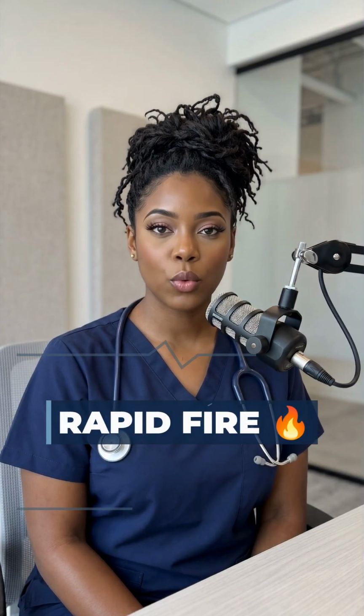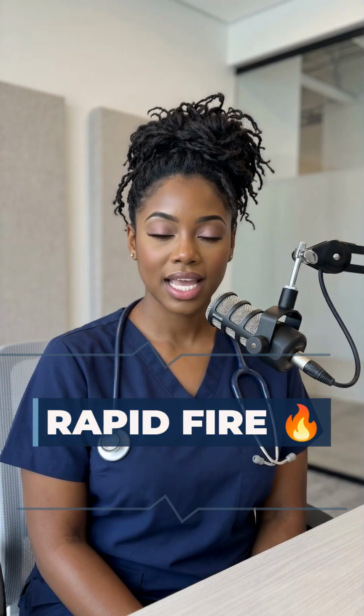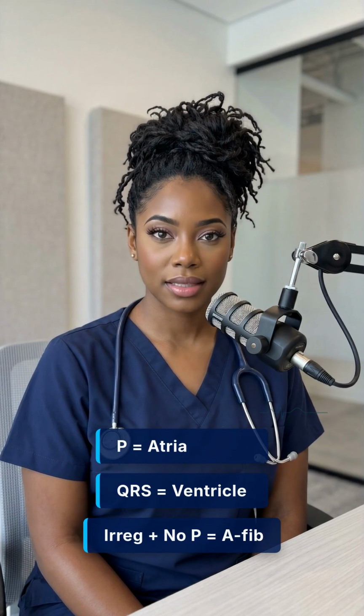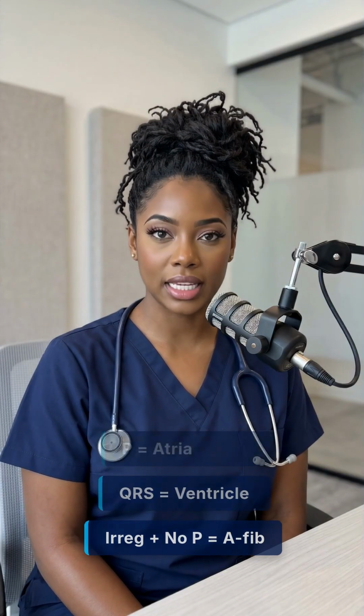Quick rapid fire before we go. 60 to 100 is normal. Below 60 is bradycardia. Above 100 is tachycardia. P wave, atrial signal. QRS, ventricular contraction. No P waves plus irregular rhythm equals atrial fibrillation. Lock that in. And that's EKG basics, simplified.